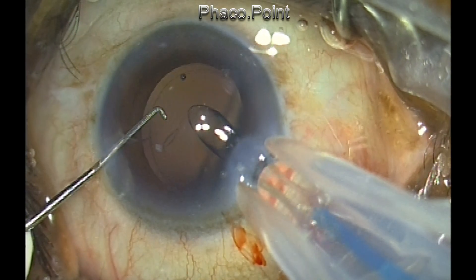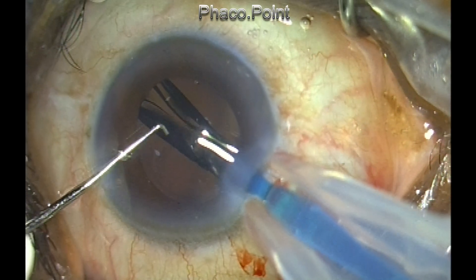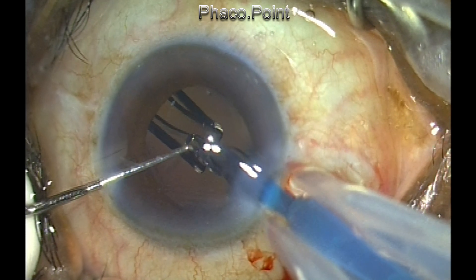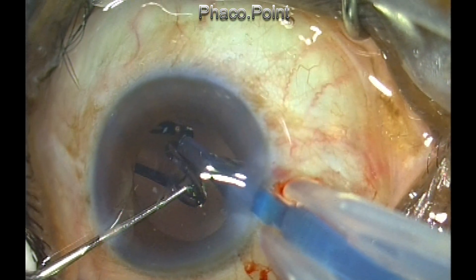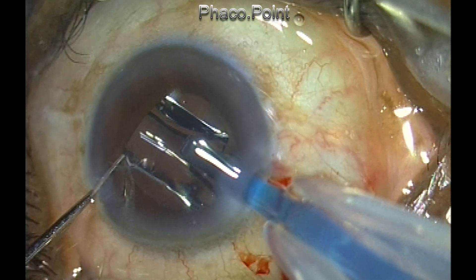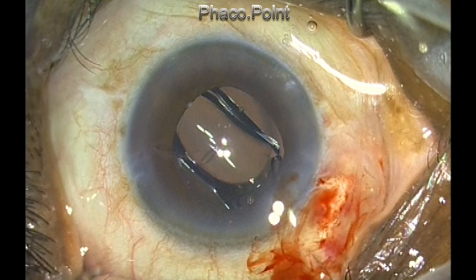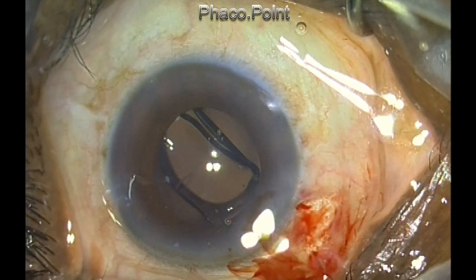While injecting these lenses, many people note that the lenses tend to tumble. This is because the trailing haptic is folded across the pusher. One method is to use a Sinski hook and gently create a lateral movement of the trailing haptic, which will enable you to place the lens in the bag. Let's watch this technique again.